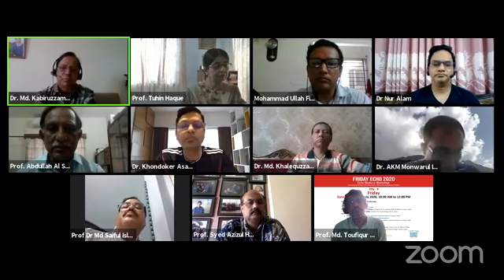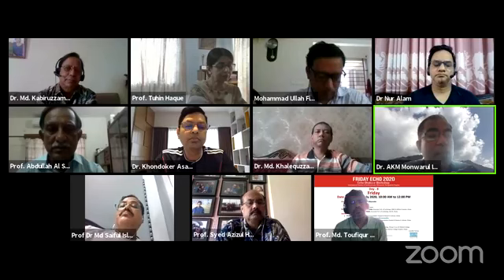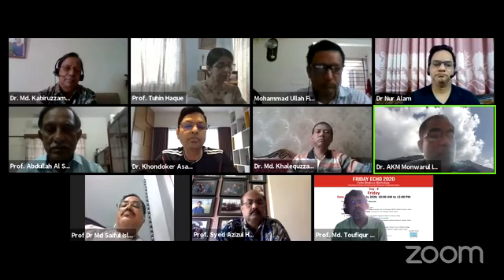Thank you. Thank you, sir. What is the position of the sample volume to get the prosthetic valve VTI? This has been asked by Dr. Azizul Haq Sohel.